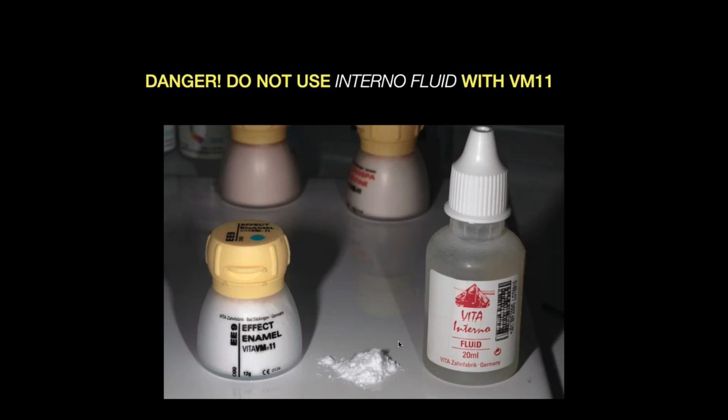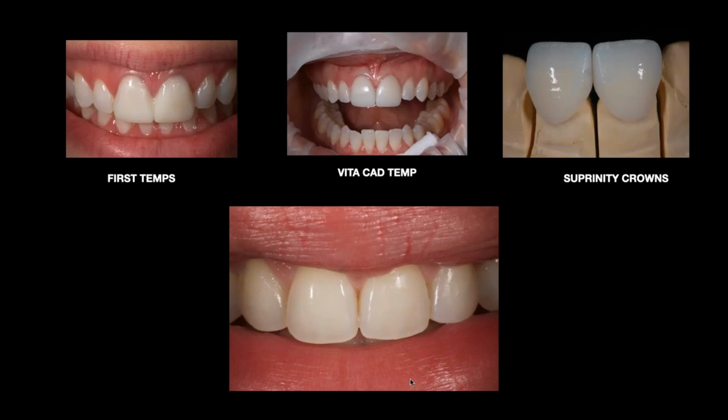Now, if you try to put internal colors using the old internal liquid, you cannot. This will not burn out properly because this fires like around 760, really low. And so you need to use the regular modeling liquid to paint in the effects. If you're going to use the internos, which I don't use those anymore, I just use the Accent Plus colors. And here you can see the crowns after I finish building them up.